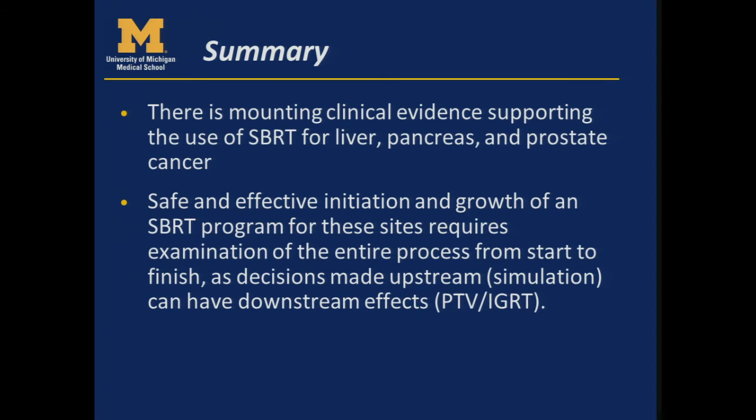And so in summary, for both of the talks, we think there's mounting clinical evidence supporting the use of SBRT for liver, pancreas, and prostate. And the safe and effective initiation and growth of a program in these sites requires looking at your whole process, from decision making from the physician side, from tumor board, simulation, treatment planning, and IGRT.